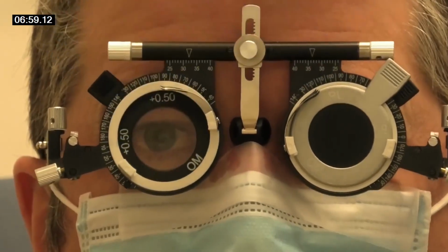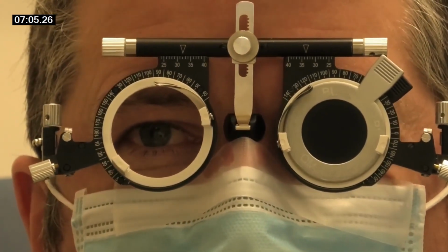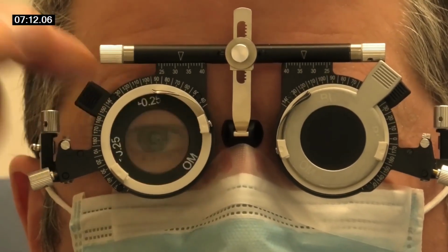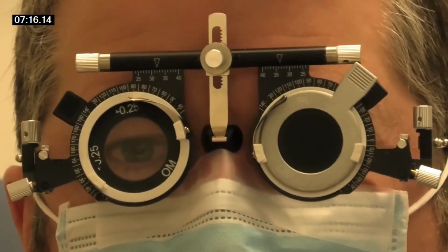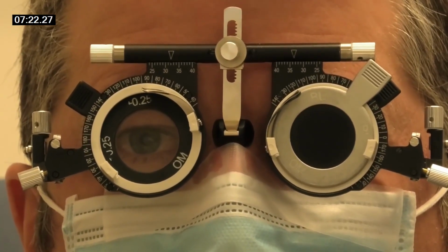A bit clearer? Yeah. So you've never had your eyes tested before. So you just pulled the lens out now, you see. So you're not supposed to do that. Oh, because it's a plus lens. Yeah, that's right. But interestingly, that plus one thing that we did earlier on, we sort of didn't really even need to do that in some ways because you're doing it with this now, aren't you? Yeah. So carry on. That's fine.